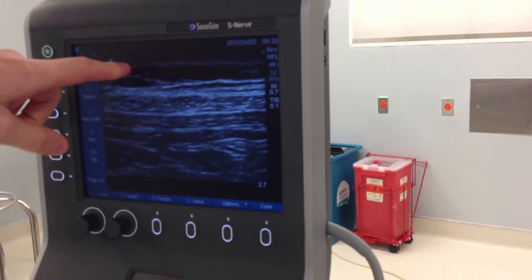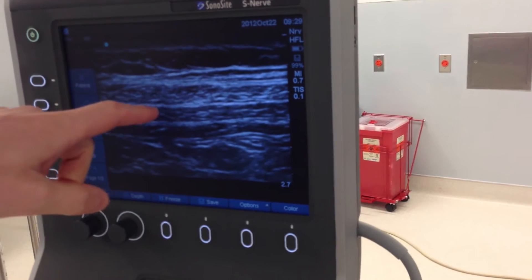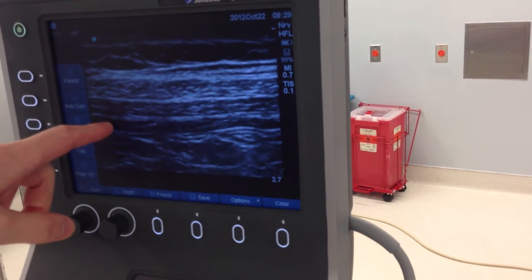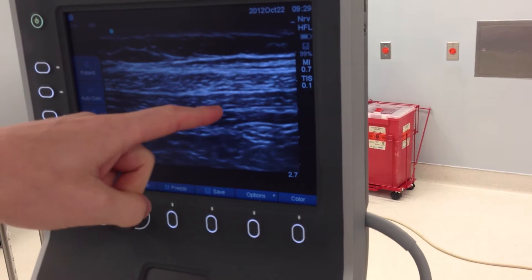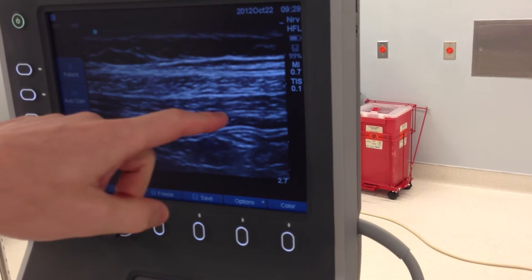So this is subcutaneous tissue. This is the external oblique. This is the internal oblique, transverse abdominal muscle, and this is the plane right here. We want to put the needle right in there.